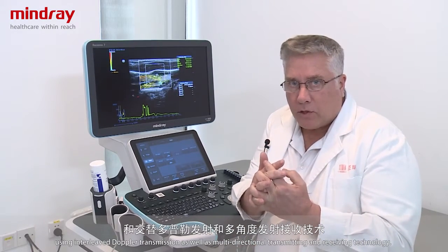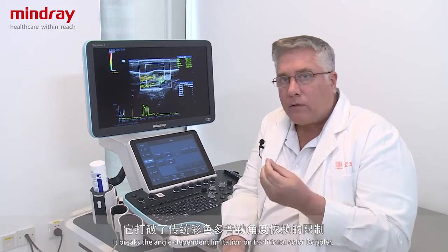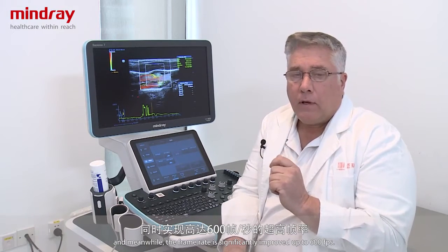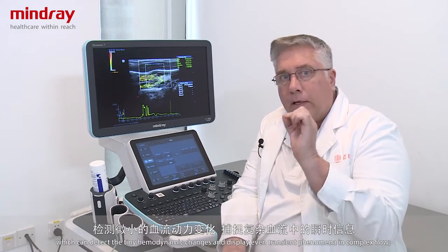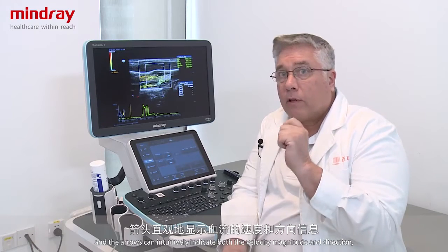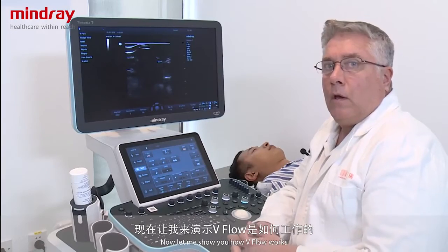V-flow is based on the powerful ZST+ platform and uses interleaved Doppler transmission as well as multi-directional transmitting and receiving technology. It breaks the angle-dependent limitation of traditional color Doppler, while the frame rate is significantly improved up to around 600 frames per second. As a result, V-flow achieves millisecond-level temporal resolution, which can detect tiny hemodynamic changes and display even transient phenomena in complex flow, with arrows intuitively indicating both velocity magnitude and direction.